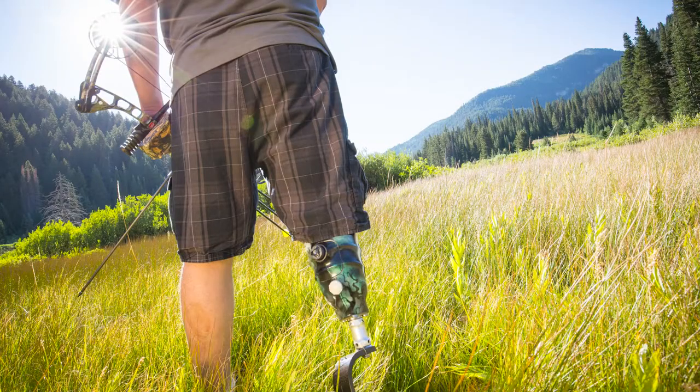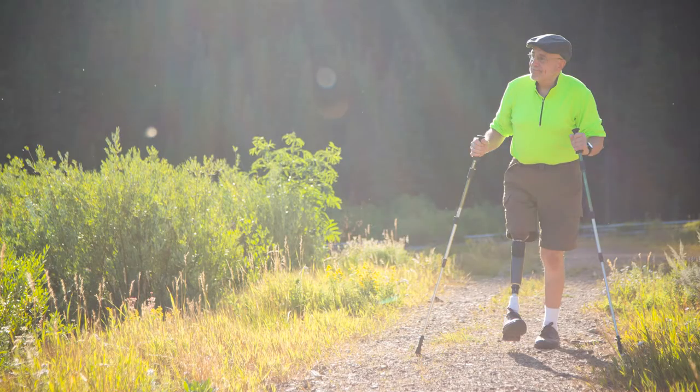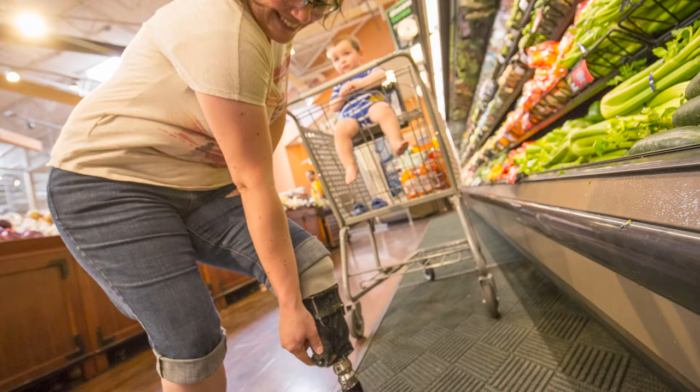Now you can learn more about why your limb changes shape and volume in the links that I've provided below. But let's get to the good part. In the past 10 years we've seen a boom in the market for adjustable socket technology. The basic gist with adjustable sockets is that they allow you to adjust the size of your socket without having to remove your prosthesis to add or take off socks.